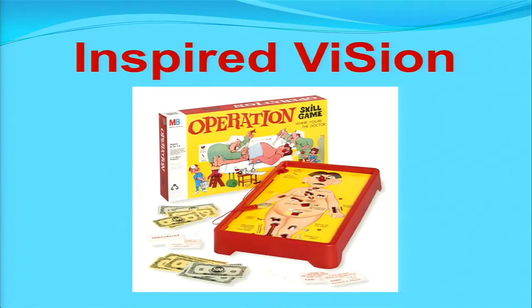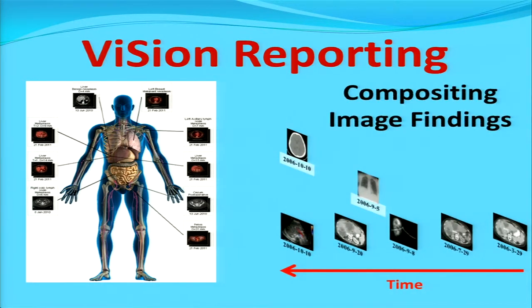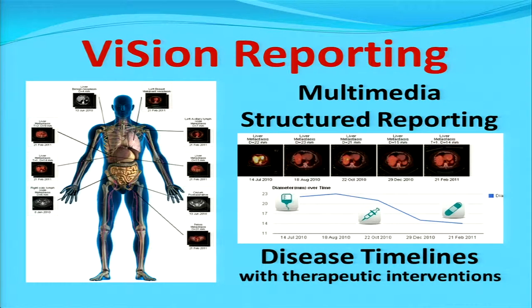We do more than that — we create a unique, novel multimedia structured report. Our inspiration for Vision is the game Operation, where on a graphic of a patient we overlay image findings. In a single view, we can see the entire radiographic history of a patient by portraying the most recent image findings specific to anatomy, regardless of modality. We are compositing images onto this graphic of a patient. If we want to see a history of a finding, we click on it and generate a disease timeline showing progression of disease, with linked images and metrics plotted out. We are now integrating treatment icons to show when treatments like surgery or radiation therapy may have affected the course of disease.